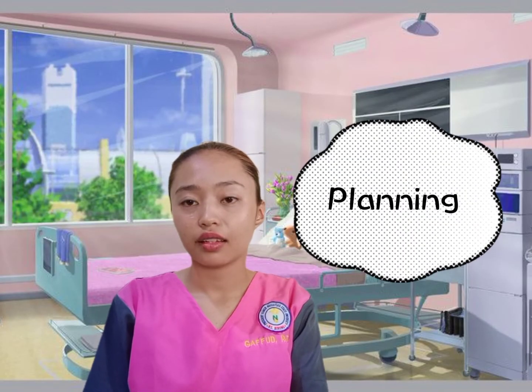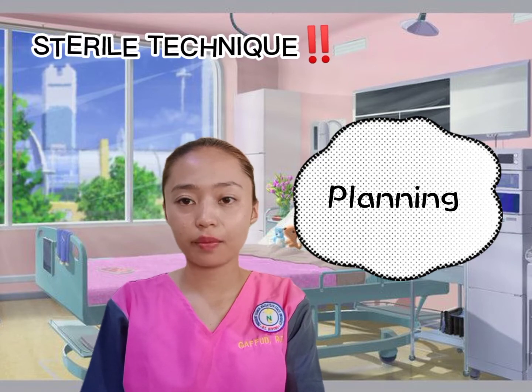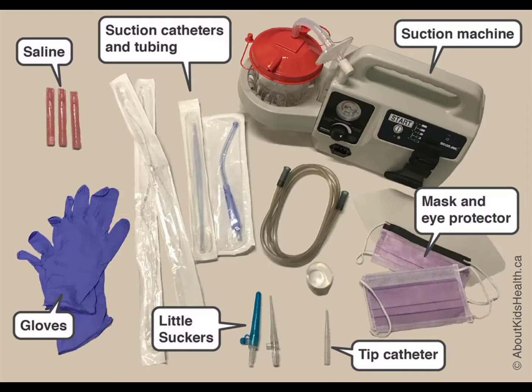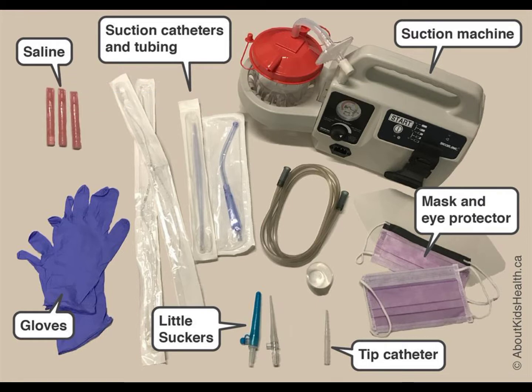For the planning, remember that sterile technique is necessary for suctioning. And then, prepare the equipment: sterile normal saline, suction source, ambu bag connected to 100% oxygen, clean protective goggles, mask or face shield, sterile gloves for open suction, clean gloves for inline and closed suction, sterile catheter with intermittent suction control port, or inline suction catheter.